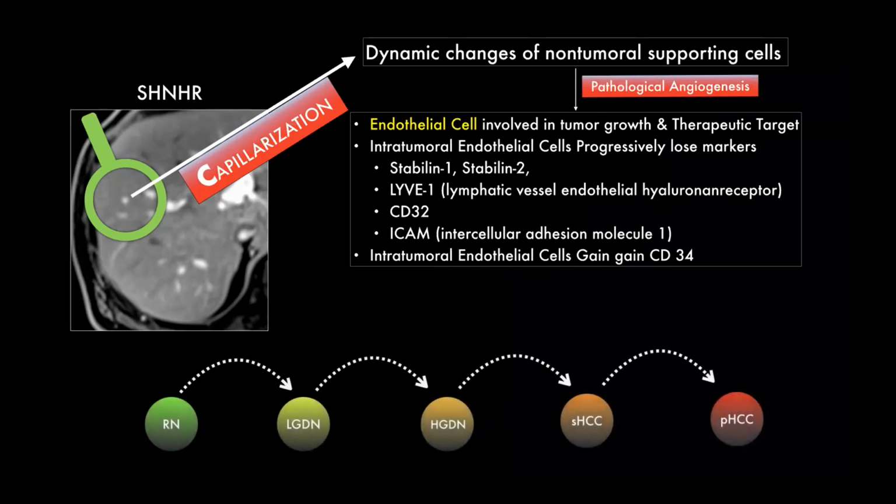Now, please understand this concept pretty well. The reason I'm telling you this is that it will change the way you image your HCCs. With better scanners, both on MR and CT, there's a tendency to go on a very early arterial phase. When you go too early, the contrast remains primarily in the aorta, as well as the celiac trunk and the common and proper hepatic artery.